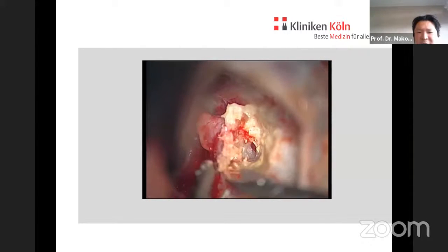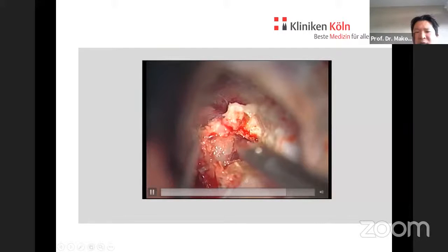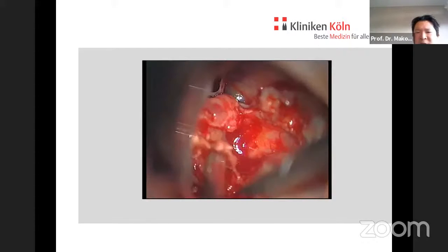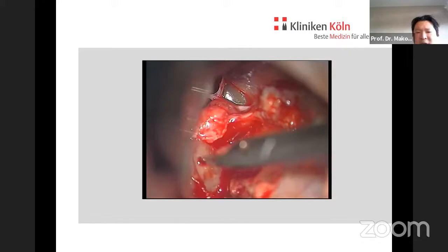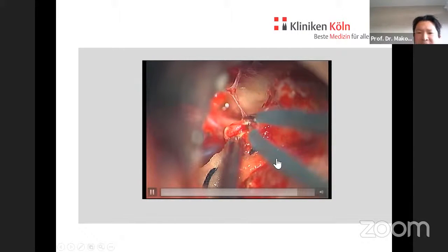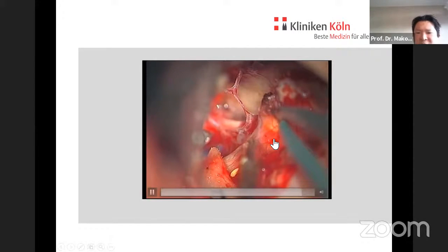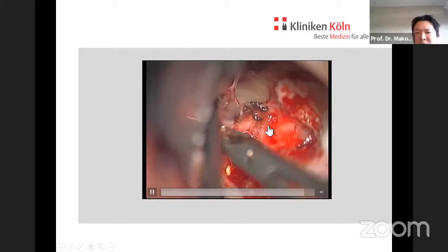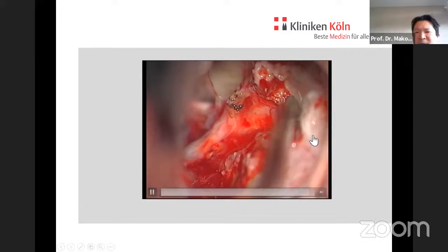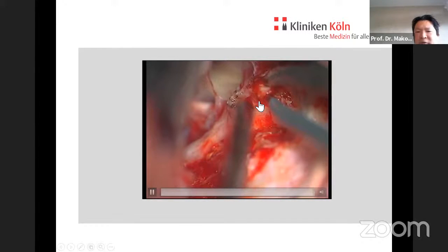The canal is opened, and in the internal auditory canal, you have got the right order of the nerves. So you can once more identify the facial nerve, which is in the standard fashion, lying in the superior part, frontally, ventrally. And then it's possible to go to the porus and remove the last part at the porus, and you can see nicely the facial nerve there. So I think this is quite safe to do because you can lose the facial nerve just right here at the porus when you follow it from cisternally. So it's, in my view, better to open the internal canal in between, identify the facial nerve here, and then go to the porus as the last step to remove it.